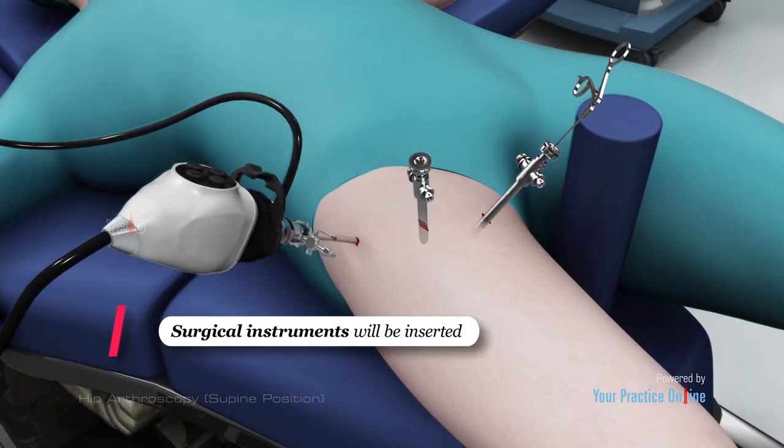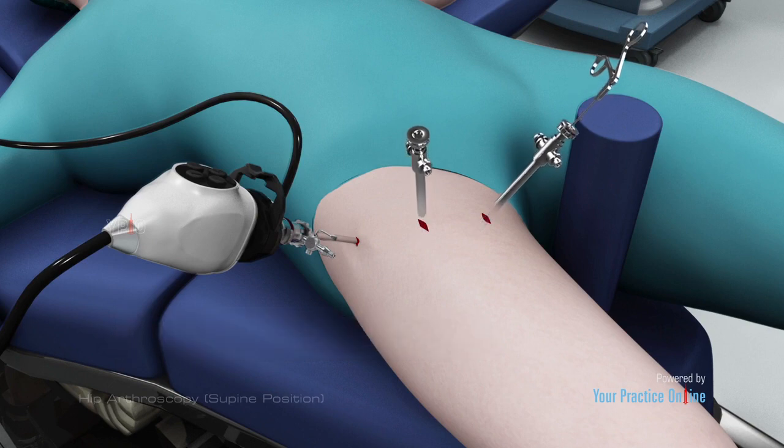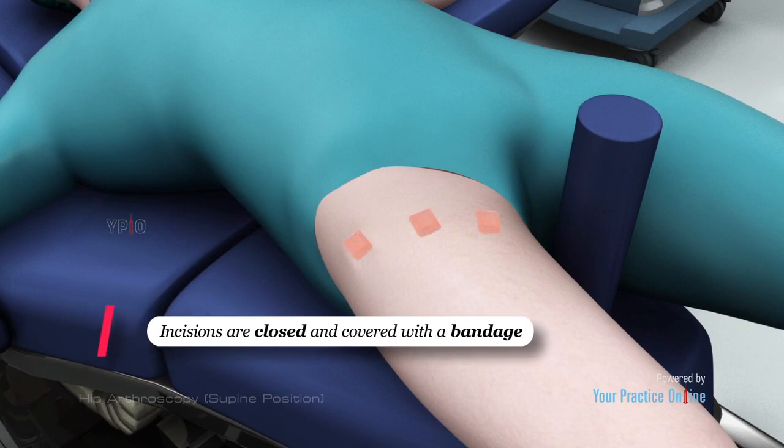Surgical instruments will be inserted through the other tiny incisions to treat the problem. After the surgery, the instruments are removed and the incisions are closed and covered with a bandage.